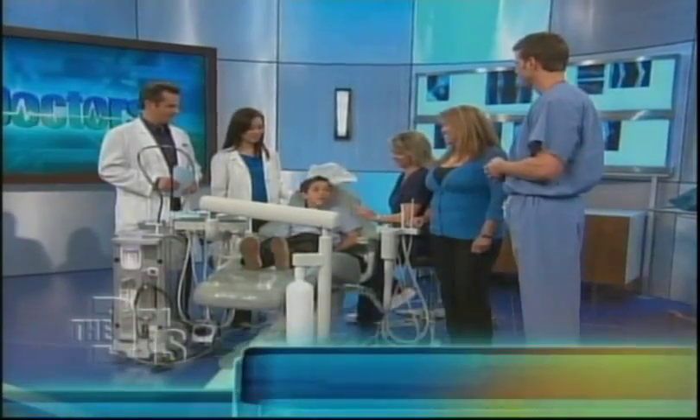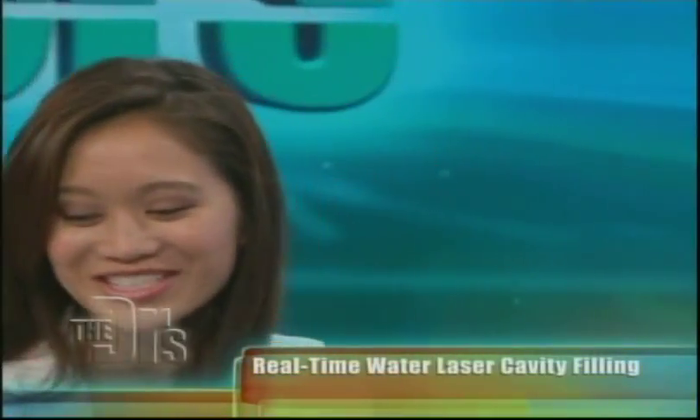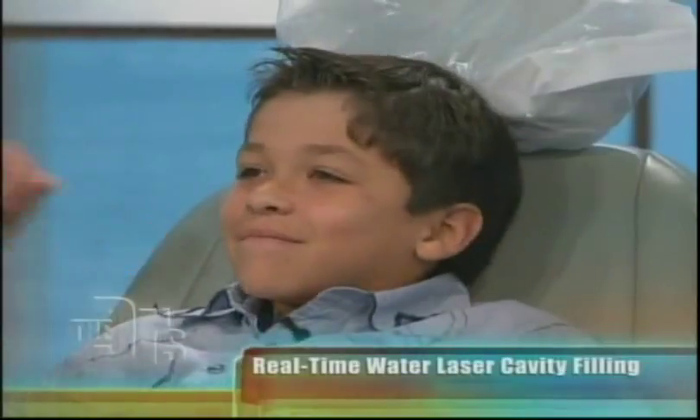In five minutes, start to finish, no more cavity afterwards. Open the mouth and let's get started. I'm really curious to see how this works.